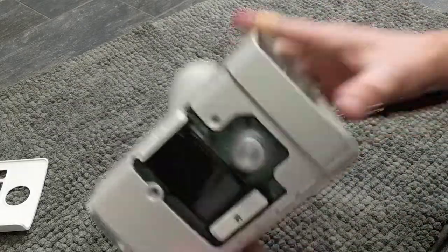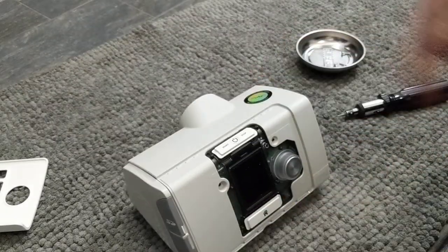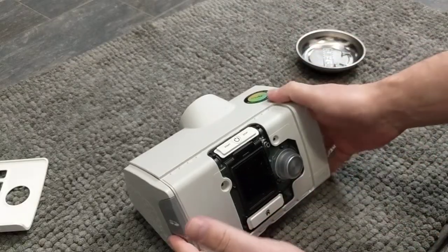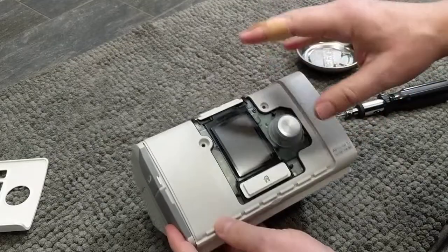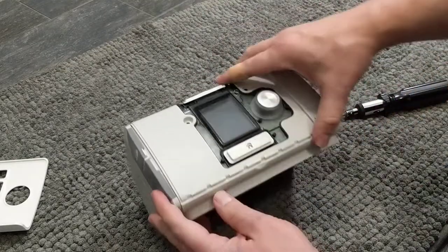I've removed the four screws. By the way, the only place you can really smell it is if you put your nose in here and give it a whiff. If it smells bad, obviously clean out that chamber. If it's the tube or the humidifier, just replace them or give them a deep clean. But if it's the actual internal part of the machine, it's harder to get to — but I'll show you how.